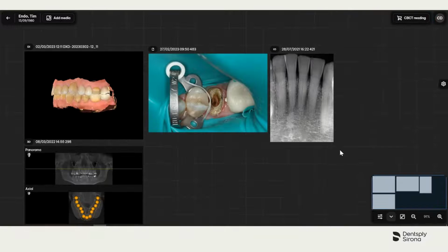We go back, and this is what was mentioned earlier to you in the presentation, that the communication canvas is a very powerful tool to flexibly arrange all of the media and to cross-reference clinical condition on additional media where the condition is visualized in different ways.